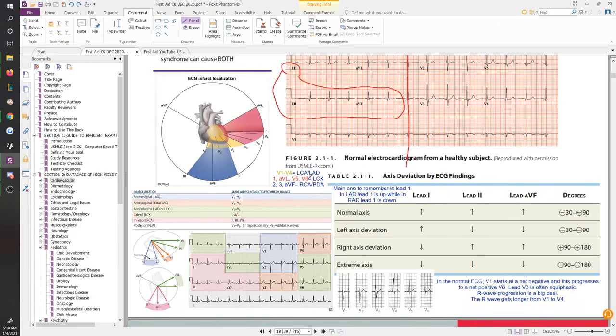So if you do perform an ECG on a patient, when you lay them down, the V1 and the AVR are the only things that are going to be on the right side of the mediastinum. You're going to put the V1 pretty much right next to the right nipple, and AVR goes on the right hand. So those are the guys that are on the right side.